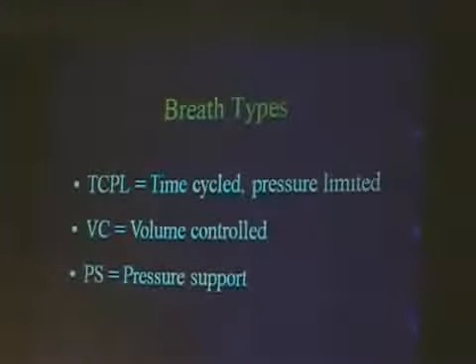Okay, now with the assist control breath, you can override your inspiratory time by turning on your termination sensitivity, and we all should do that, all right? So that doesn't happen. And they're actually automatically doing that now. I've seen on all of our ventilators, it's set usually at 5%, and we can go over that at some other time, because we don't really have time to go over that right now, but it's important to know that's the difference between assist control and pressure support.